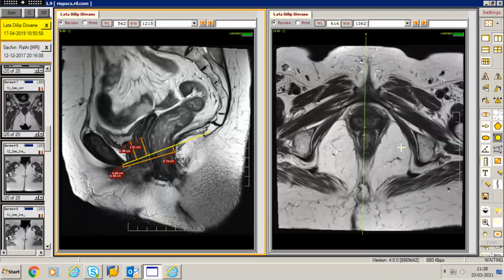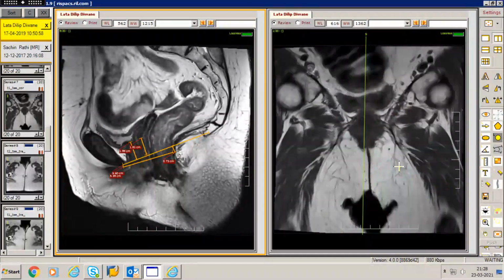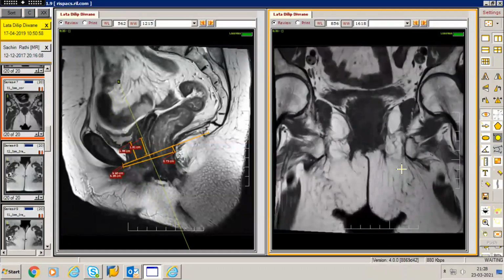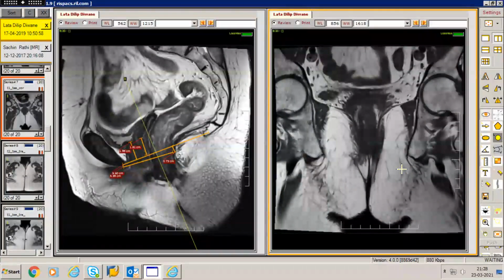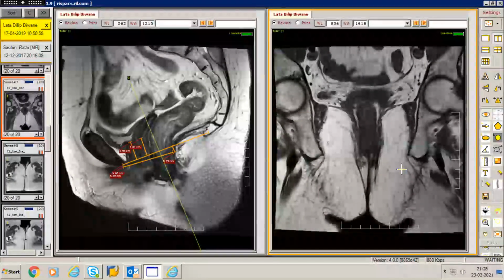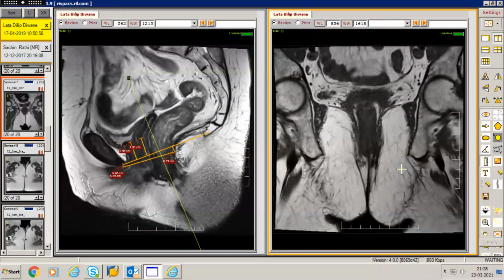Now, one thing which I want to add on to what Dr. Swaroop has said is that though we are always, Swaroop, can you put up a coronal image? Yeah. Though we are always talking about symmetry, I've got to tell you that there is no specific measurement for the levator ani thickness or the puborectalis thickness. The levator ani muscles in about 50% of individuals could be very thin, and in 50% could be very thick, but individuals with a thin levator do not necessarily have pelvic floor dysfunction. So yes, if it's asymmetric, then you're pretty good at saying that there could be a problem going on. But by and large, if it's symmetric on both sides, then you don't need to call that a thinned out muscle or a hypertrophied muscle.